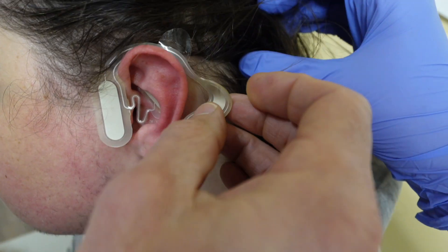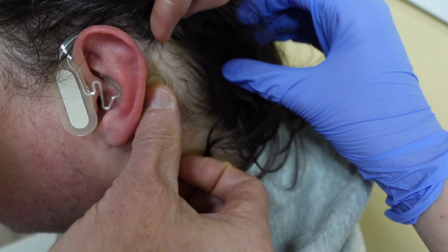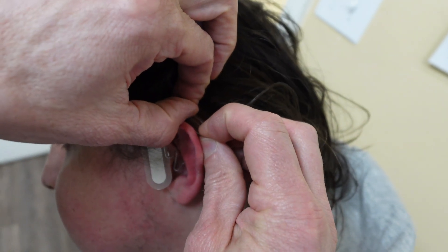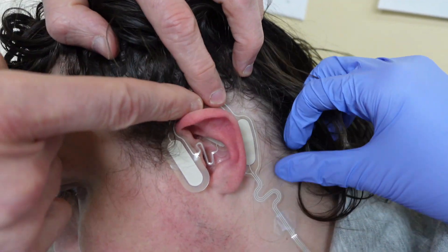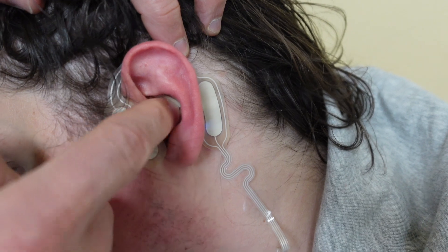It's very comfortable once it's on. You adjust the stimulation to what you tolerate. If you're having shooting pain down your neck, it's probably not in the right place. I don't know why the inner ear and outer ear probes would be adjusted separately in terms of stimulation level — there must be a reason, and I have to get more patient experience before I can answer that. But this stimulates the trigeminal and the vagus nerves, and it's much better.